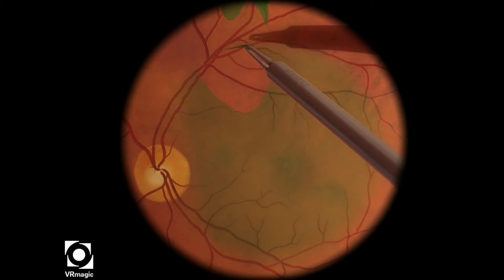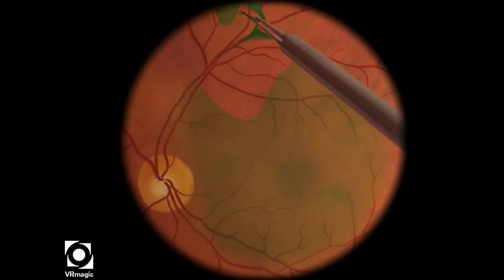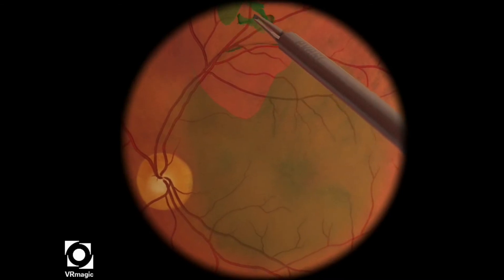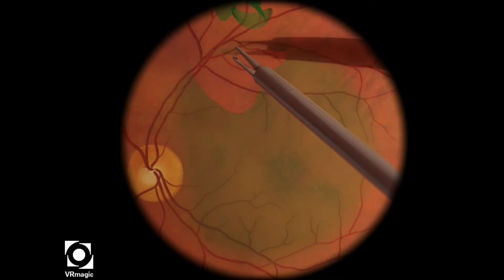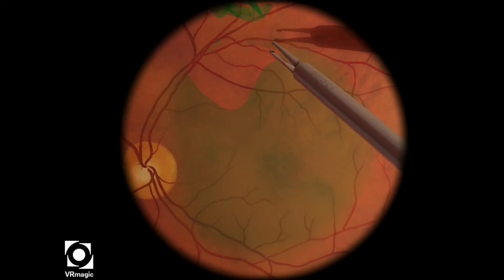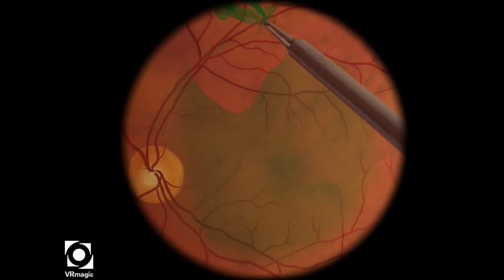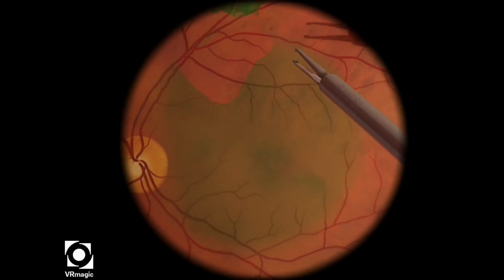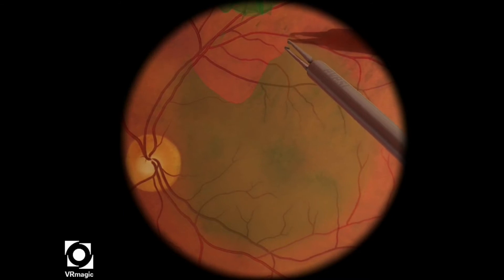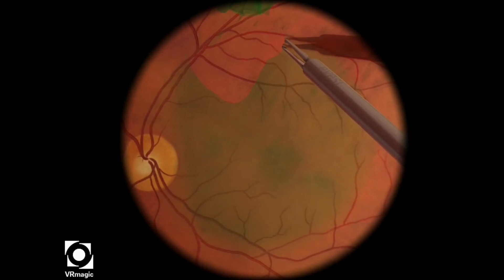In this particular case, I've unfortunately peeled a little bit too much of the superior aspect, so I'm not able to continue the peel downwards towards the macula. But that's okay — it's quite a forgiving level. That piece broke off, so now I have to start my peel from another area.